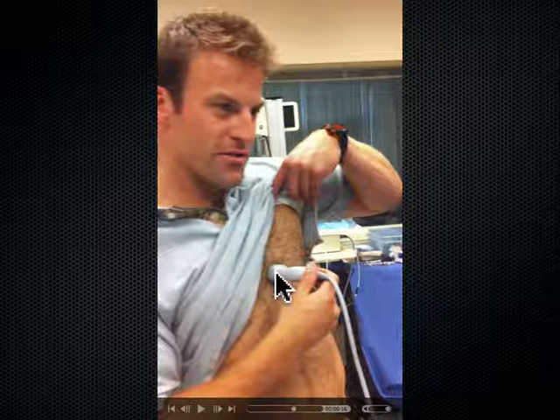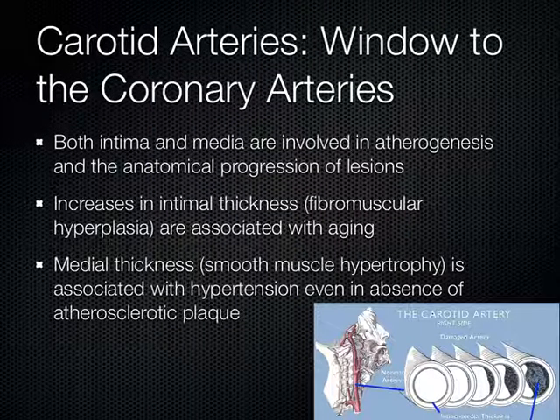This is why when we do this on patients, we lay them flat and we roll them left lateral decubitus, and that makes the PMI somewhere over here. That's where you'd be putting the probe. But I just wanted to point this out. He's a really good sport about stuff like that, so I'm sure he wouldn't mind that I stuck that up there. Any questions about that kind of stuff?